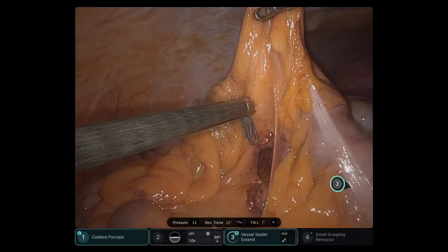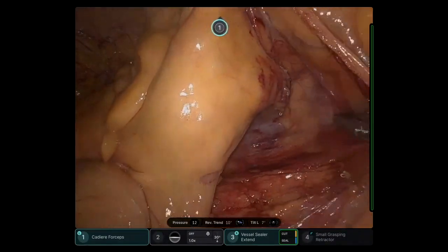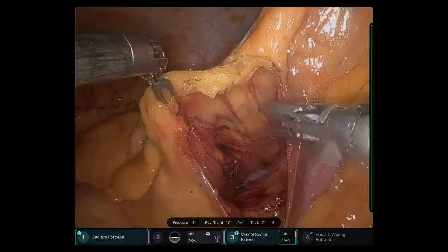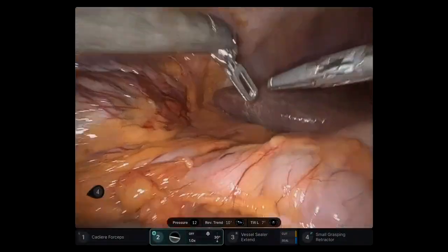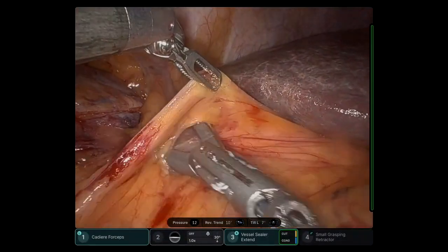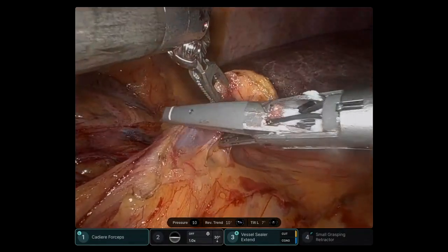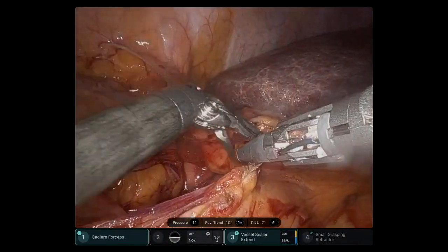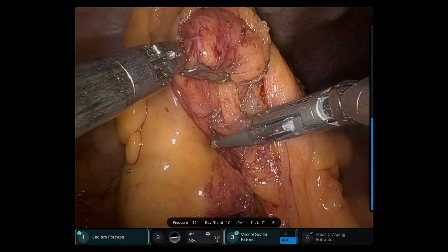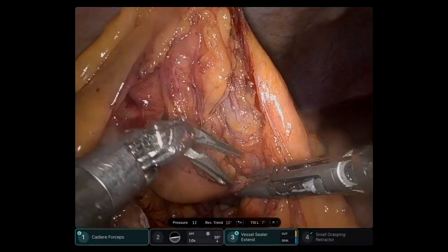Here I'm lifting the proximal transverse colon to cut the mesentery of the colon, just distal to the tattooed area. I'm trying to enter the lesser sac and now encounter the dissection that was done previously. I will finish up the last portion of the mesentery right before performing the transection.